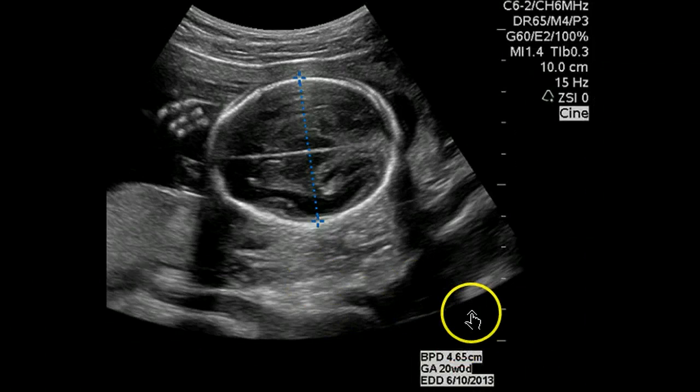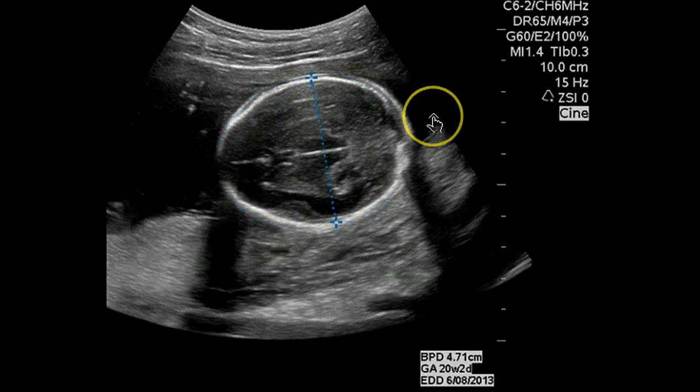I just made this a little bigger so that we could actually see these measurements. Nice biparietal diameter. We're not seeing the cavum itself, but we're seeing the columns of the fornix just below the cavum, which is fine. The thalamus and the tentorium cerebelli, which is above the cerebellum. If you're seeing the cerebellum in this picture, you're actually measuring too obliquely, and you're going from outer bone to outer bone to inner bone, which is fine. This we like. It's pretty tight to the calvarium, a little bit out here, but not a big deal.